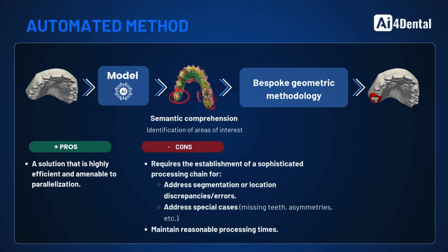However, implementing these techniques presents challenges for developers. The processes are complex, especially the geometric parts, as identifying zones within the oral cavity can fail or produce errors. Robust solutions are needed to automate thousands of cases daily. Additionally, processing times must align with laboratory workflows.